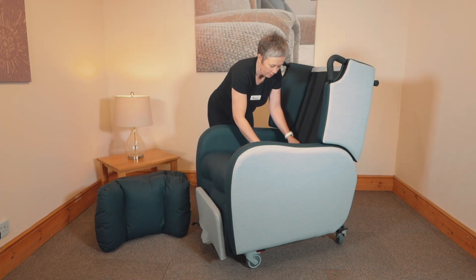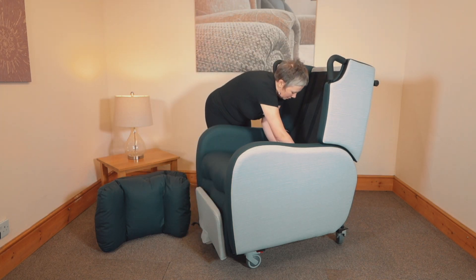The chair also features lockable castors and an adjustable foot plate. The Boston is made to order and made here in Great Britain.